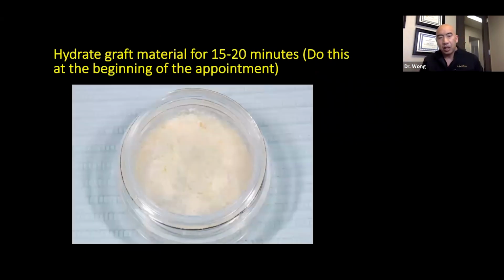You're going to have your mineralized cortical bone in its jar already, and all you're going to do is hydrate it with sterile water or sterile saline. Be sure you stir it around though, because if you just dump water in it, only the top part of those particles will get hydrated. It doesn't get to the bottom, so you've got to stir it around really well.